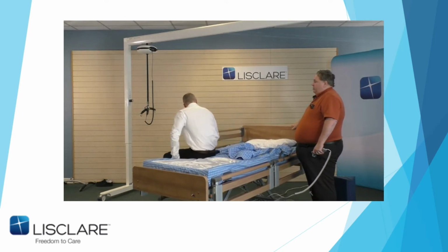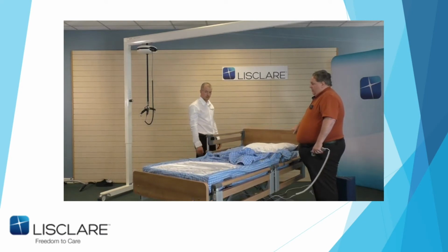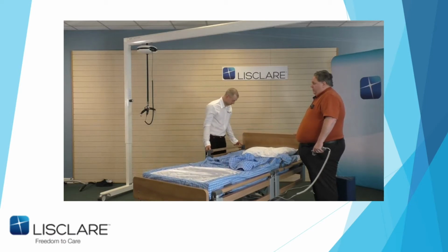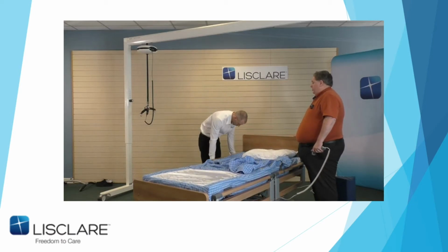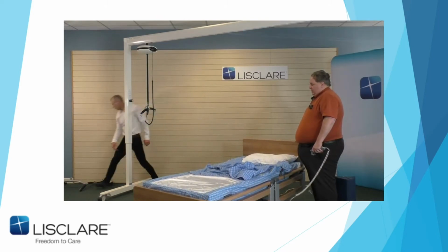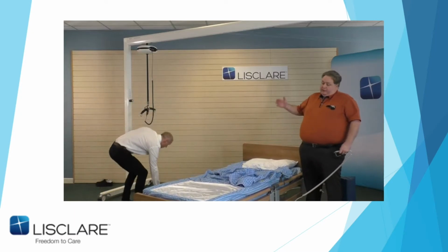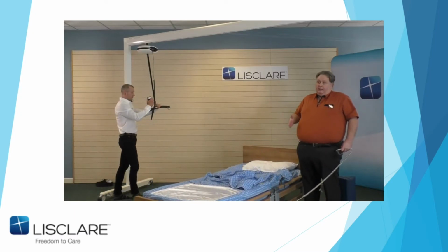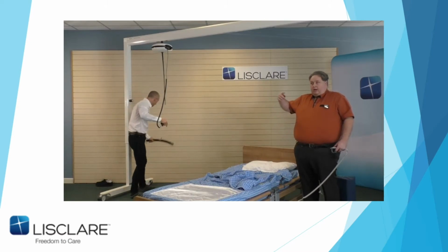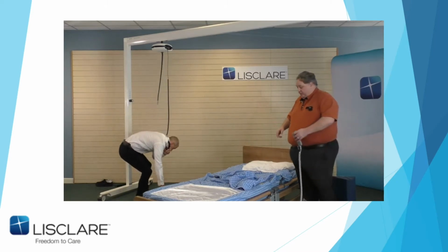So you've seen John, pardon the expression, turning me, or sorry, bringing me up the bed. So he's going to change things around a wee bit here. So he might have to change the spreader bar, John. Again, just to put on the plus size one, please. And this will do both. So what John's going to do is use the gantry to move me to the side of the bed. Then he's going to disconnect one half, use the shorter side, and rotate me. But John has to always try and stay within my field of vision.